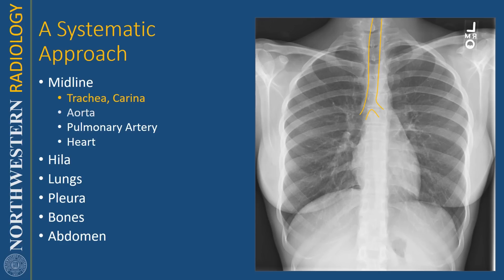Now that you know the anatomy of the mediastinum a little bit better, I want to talk about how I personally look at chest radiographs. The way I look at it is actually the way that we just reviewed the anatomy — I start from the midline structures and then go out from there. So the first thing I do is look at the trachea and make sure I see its normal deviation slightly to the right because of the aortic arch. Then I look at the airways and the right and left main stem bronchi, then move on to the aorta.